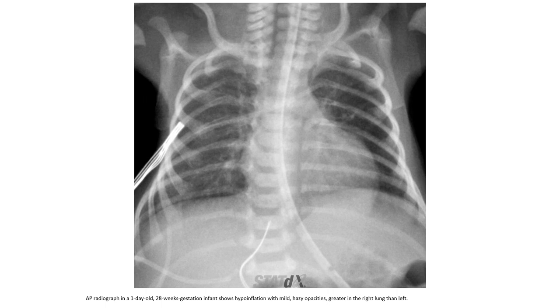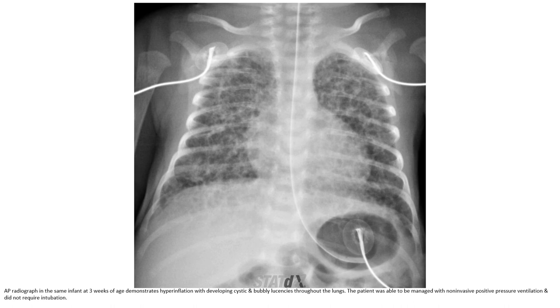This is the AP chest radiograph in a one-day-old 28-week gestation infant, showing hypoinflation with hazy opacity greater in the right lung than left. Again, this is the AP chest radiograph of the same infant at three weeks of age, demonstrating hypoinflation with developing cystic and bubbly lucencies throughout the lung. The patient was managed with non-invasive positive pressure ventilation and did not require intubation.